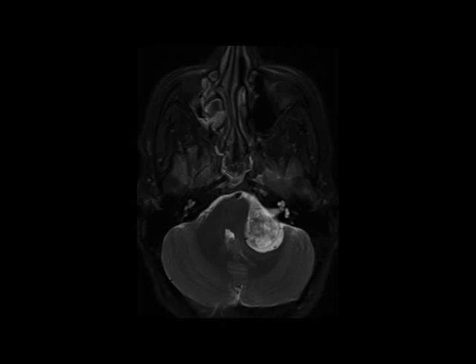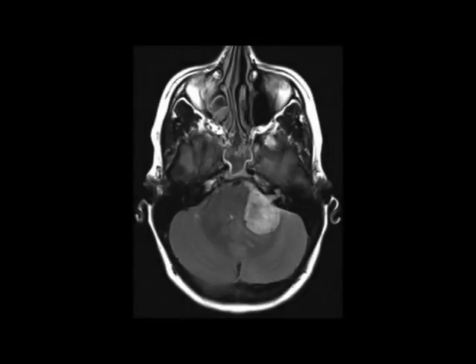There is also a small volume of perilesional edema present within the left middle cerebellar peduncle. The FLAIR-weighted image demonstrates a heterogeneously hyper-intense mass, expanding the left internal auditory canal with flaring of the left porous acousticus.